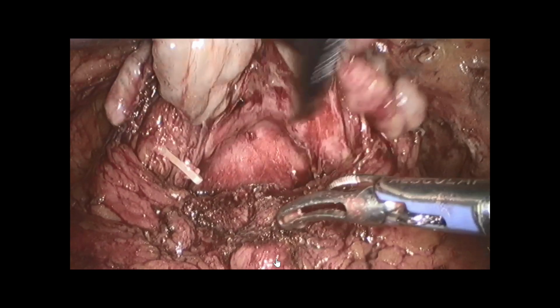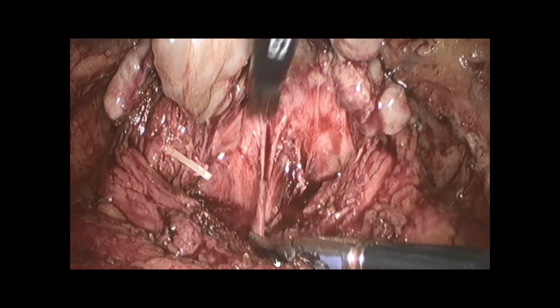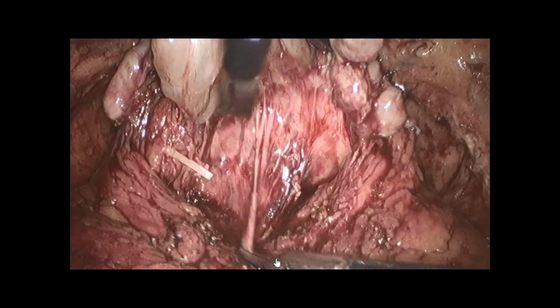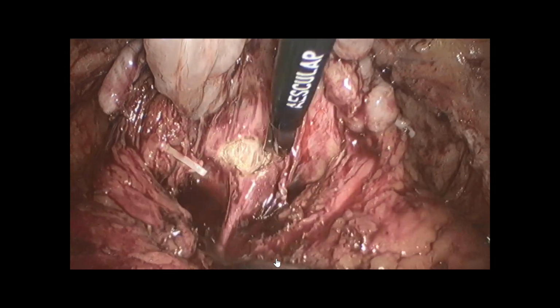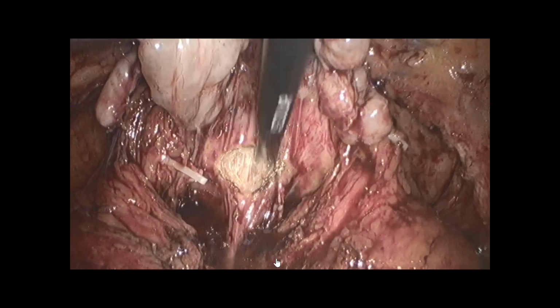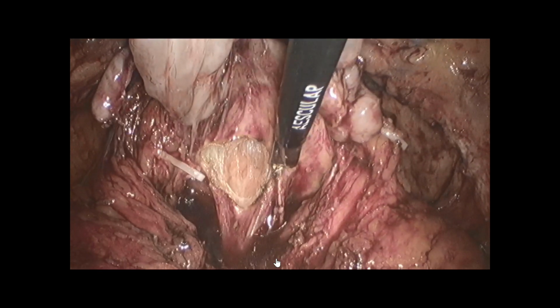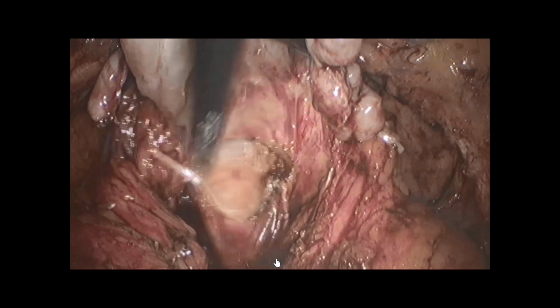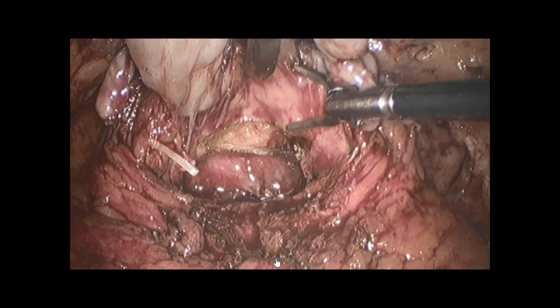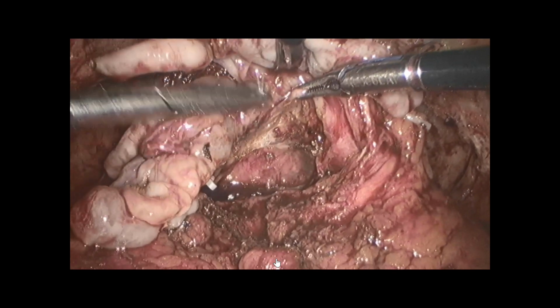So now you lift both seminal vesicles, and what is important, as I said this morning, is to leave about 1 centimeter. You incise about 1 centimeter because I will use this part of the Denonvilliers fascia to catch it, like a solid membrane. Okay, and you see here the fat. It's a prerectal fat, and I will give this part to my assistant.